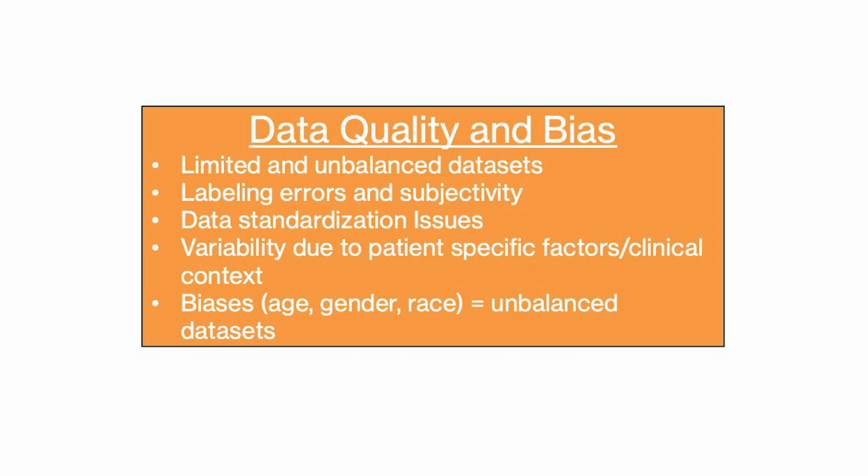So rotation of the heart, patient's innate electrical activity, all of these are also going to be biasing some of the data quality. And then age, race, and gender is also going to create a lot of unbalanced data sets. So it is really crucial to look at the data sets that you have to look for generalizability. Then you look at model generalizability and robustness.